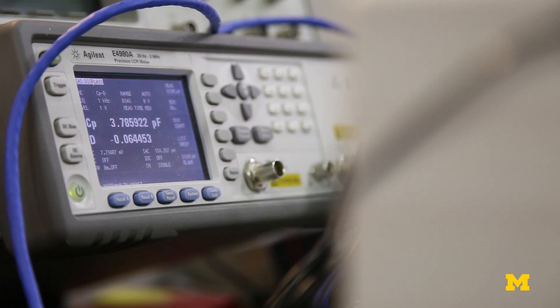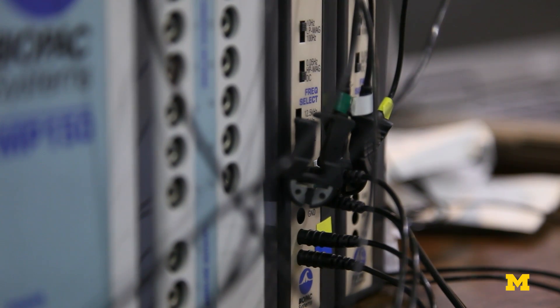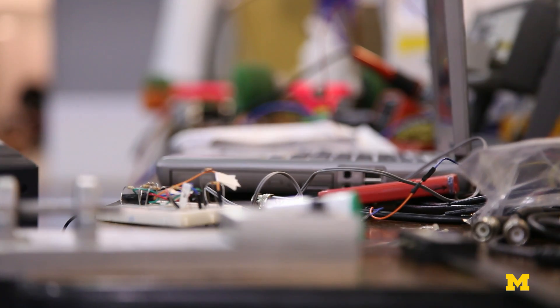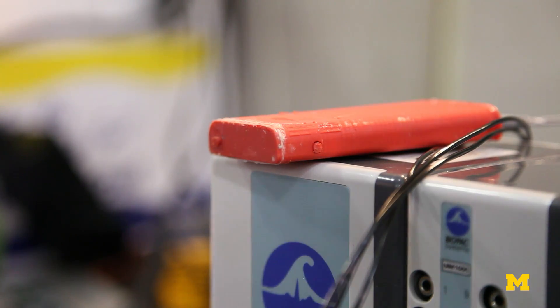We've gone from something fairly large with a computer and a tabletop to something that resembles a nano iPod, for example, that you can wear on your arm.